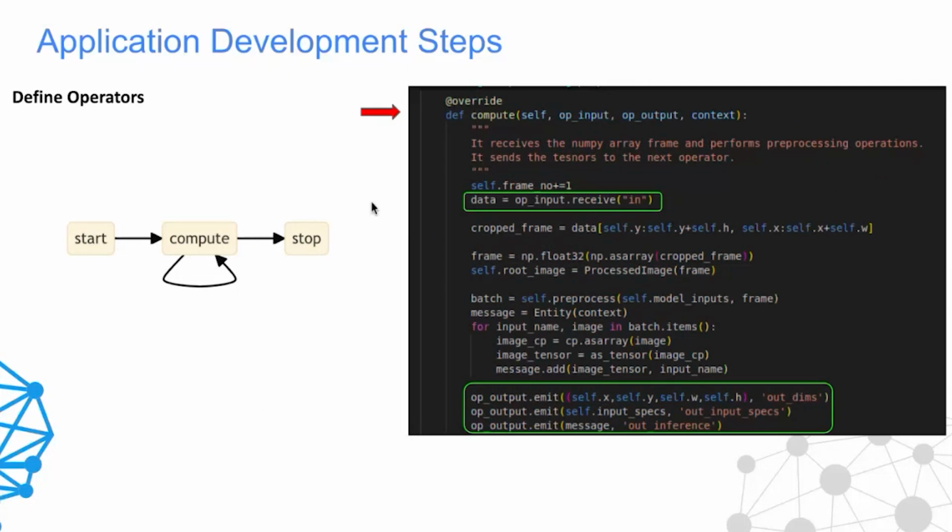Over here is an example of the implementation of a compute method for a pre-processing node. It is important to keep in mind that until the receive API is invoked, there won't be any transfer of data from one node to the other. Once the data is received, then the rest of the code is executed. And finally, at the bottom, we can see that it is transmitting all different kinds of data to its different output ports.